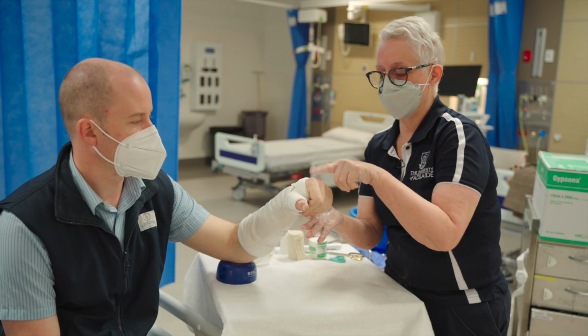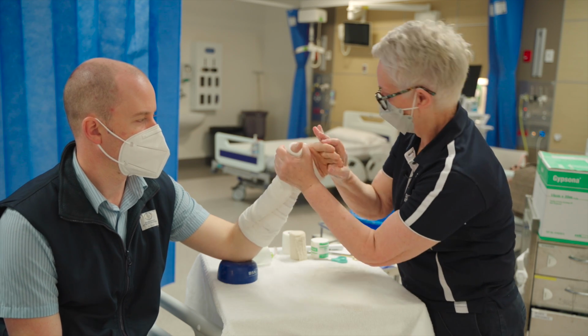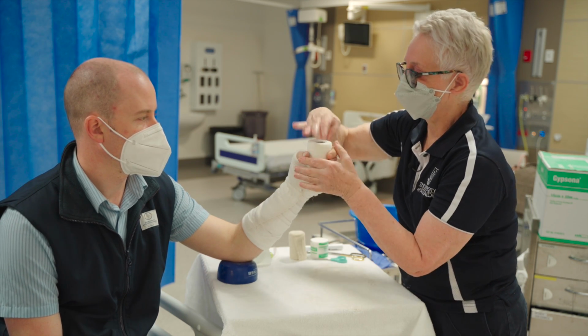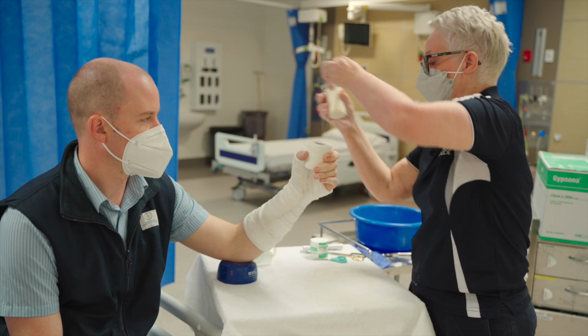Bring that down. So now we've made sure the metacarpal heads are free, the palmar crease is there, and we'll just do another quick check on that position to make sure we're good. Patient can hold that for a minute or two.